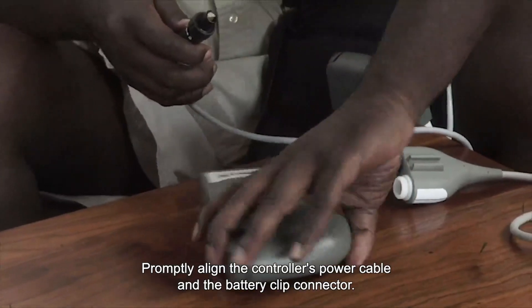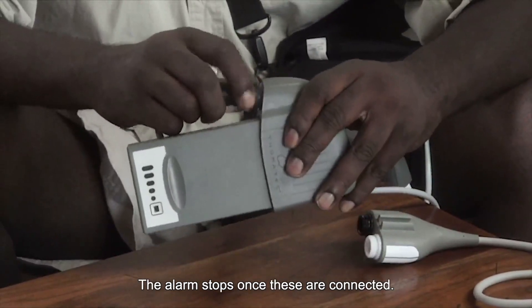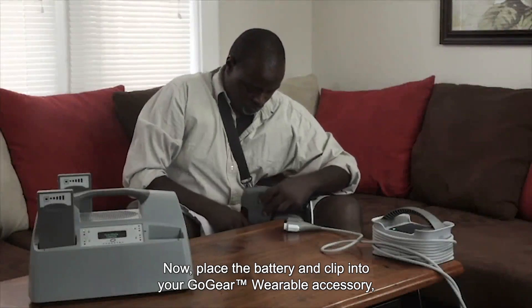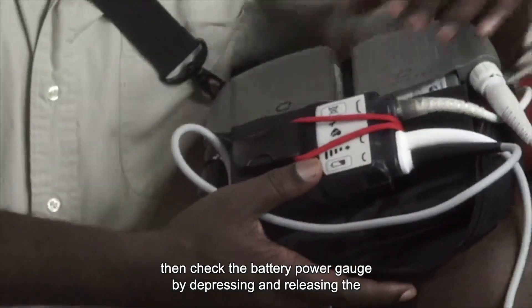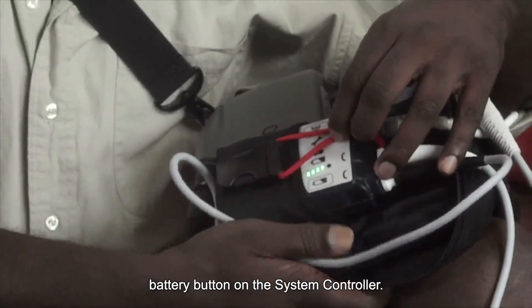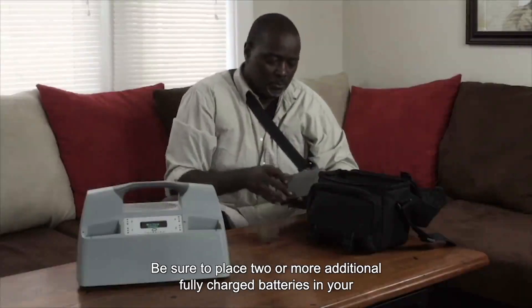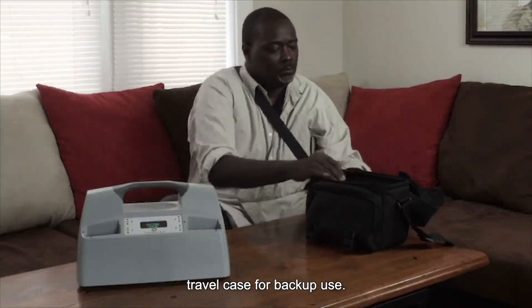Promptly align the controller's power cable and the battery clip connector. The alarm stops once these are connected. Now place the battery and clip into your GoGear wearable accessory, then check the battery power gauge by depressing and releasing the battery button on the system controller. All four bars should light up. Be sure to place two or more additional fully charged batteries in your travel case for backup use.